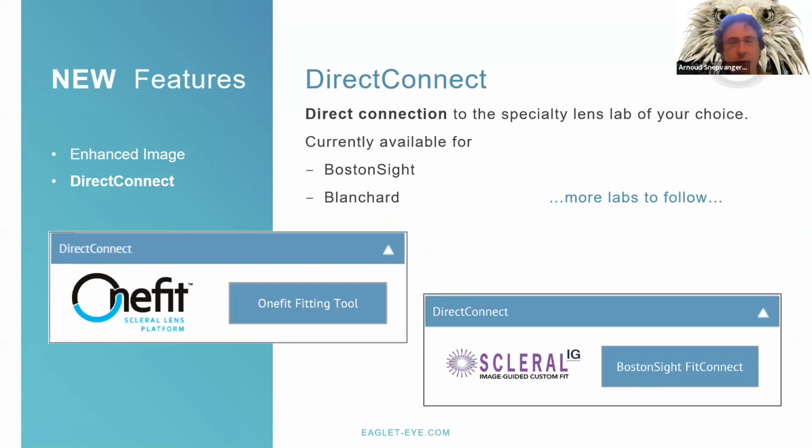Sorry, Reinier, there's a question from René Reader. So should we export and send you the file if we have someone actively being fit? If it is required for a new lens order or a reorder, yes. So yes, the answer is yes. And use the support button, and that's the secure way to send that measurement to us. And please make a note, or in the notes say what you require, of course, and that way we will be able to help you in the fastest way possible.